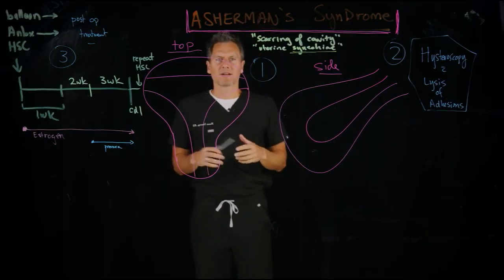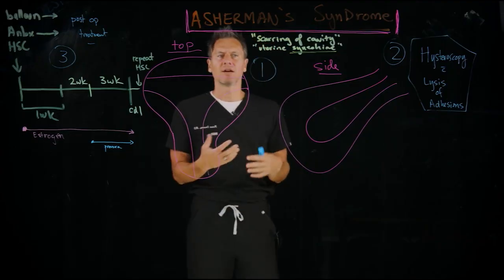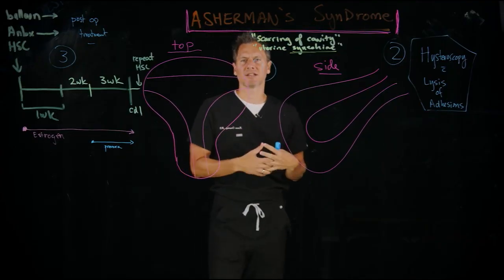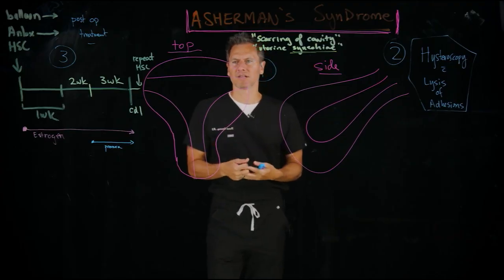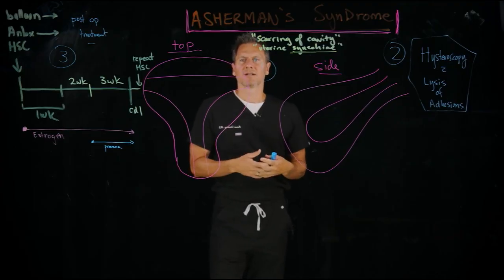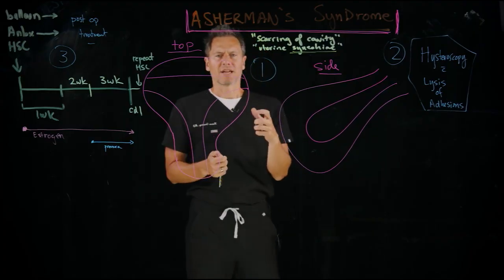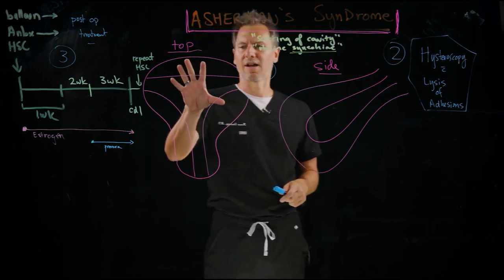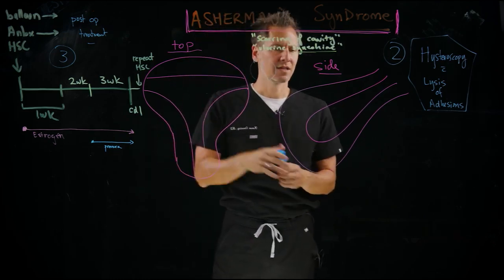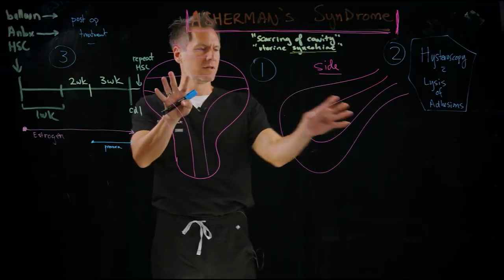So as I talked about in a prior video, in order to set expectations about the extent, or to at least measure the extent of any scarring in the uterine cavity, a saline infusion sonohysterography is usually the first line testing, which is a vaginal ultrasound where we instill saline and then we can assess the extent of scar in the cavity. Here I have a top-down view of a distended uterine cavity, and here's a side view. This is normal.